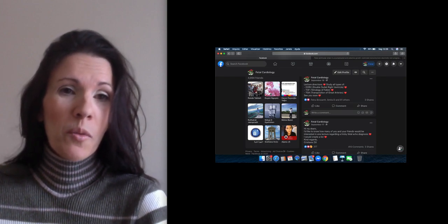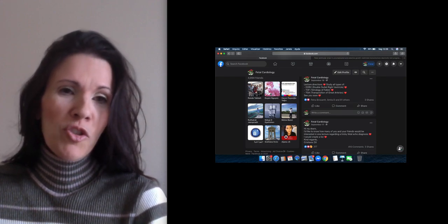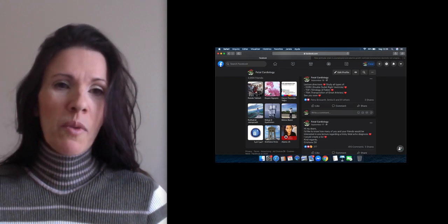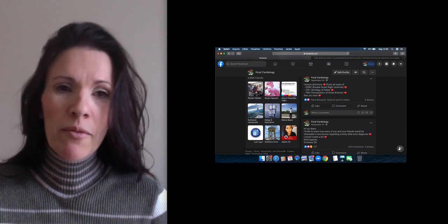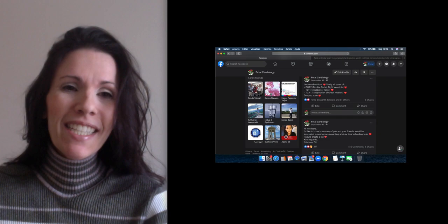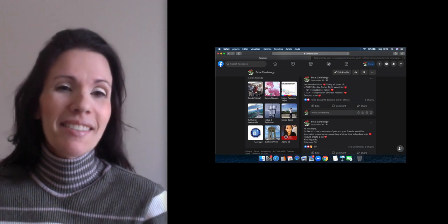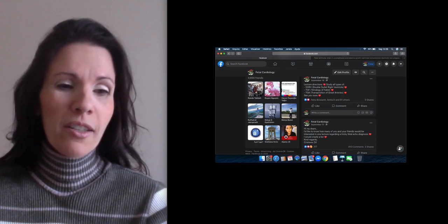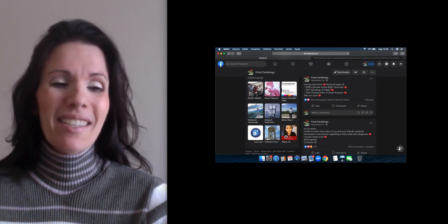At that time, when I made that question, I had one special case in mind, which I will make a comparison among DTGA, CCTGA, DORV, and TOF. But after that, I received another case, more interesting, trickier than the first one, so I present this case. It's a surprise, okay? Try to follow my thoughts and let's see if you can make the diagnosis.